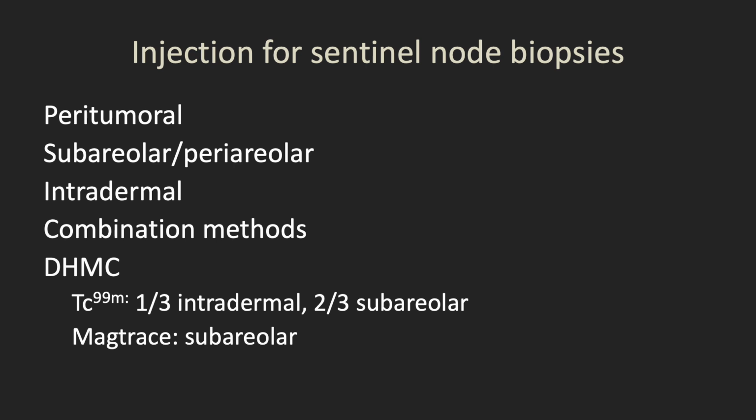So at DHMC, for technetium, and we use Lymphoseek, we inject 1/3 of the dose intradermal, 2/3 subareolar. The intradermal injection is at 12 o'clock, so we don't need imaging guidance. If we're doing Magtrace, we just inject the single dose in the subareolar area.